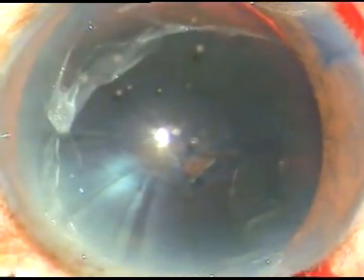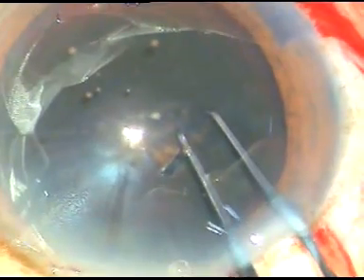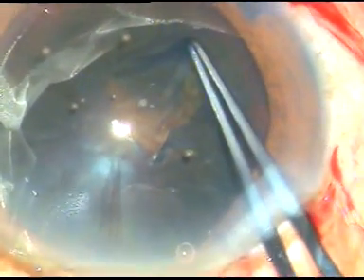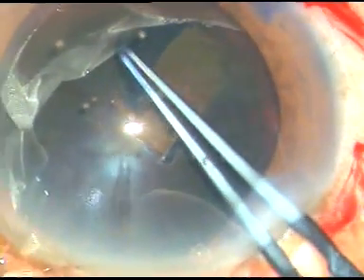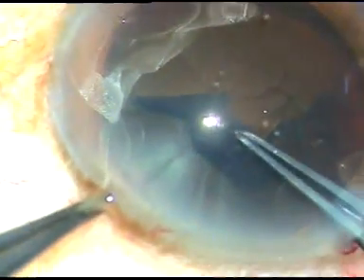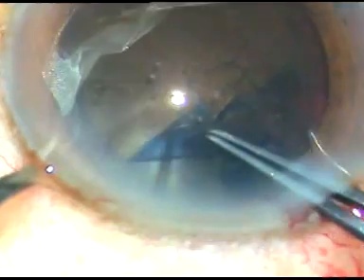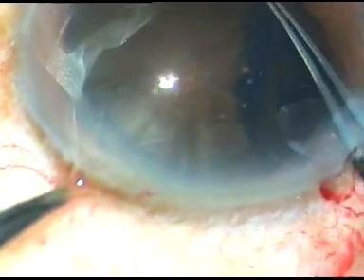Now with the help of Utrata forceps, I hold the capsular tag, go anticlockwise, and do a large capsulorrhexis, about 6 mm or so.